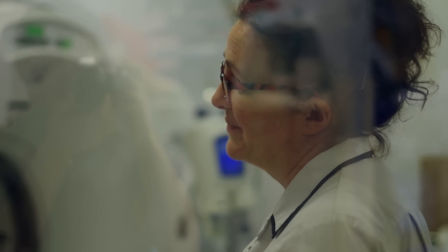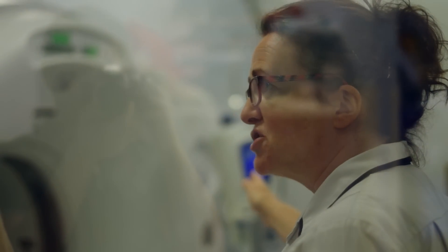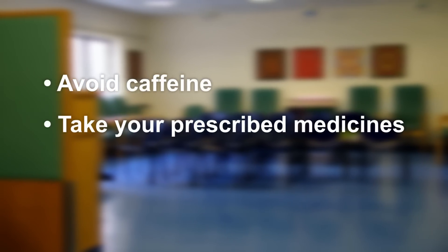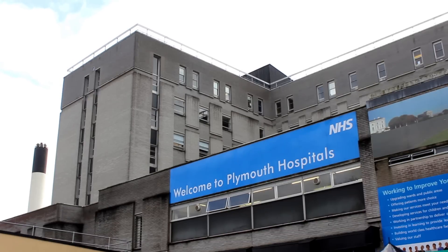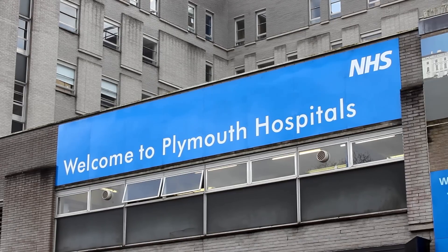When you come for the test, please remember this is a partnership between us. We'll do as much as we can to get clear pictures of your heart, but you can really help by holding your breath and keeping your heart rate nice and low — by avoiding caffeine, taking your prescribed medicines, and trying to keep as relaxed and calm as possible. Hopefully now you have a good understanding about what the test is going to involve. If you have any further questions or worries, please get in touch using the number on your appointment letter, or you can ask any of the staff on the day.